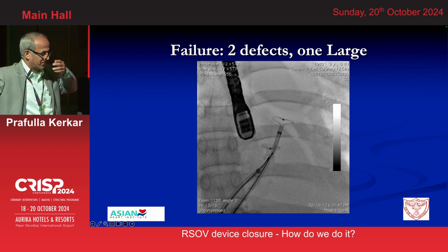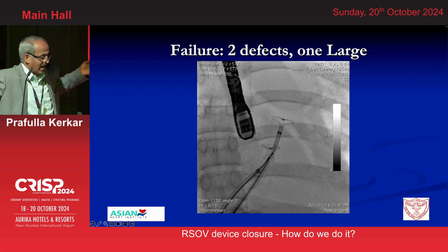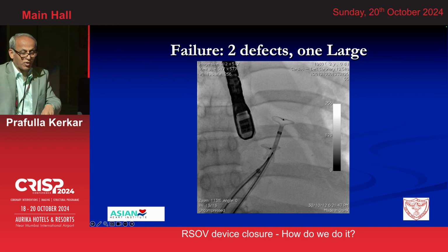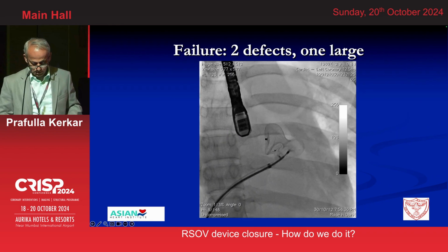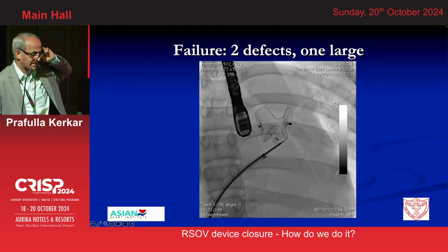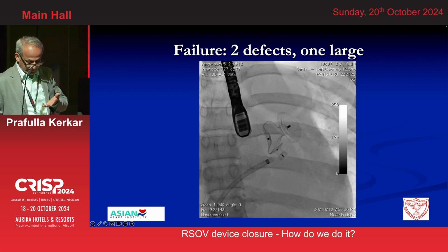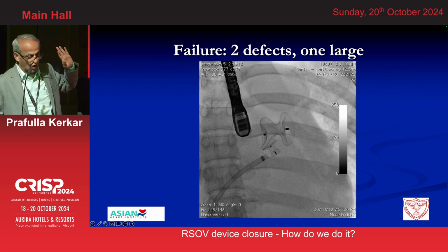The patient was virtually in multi-organ failure, a goner kind of a thing. Here there were two defects, and we crossed twice. We managed both, and we released the smaller defect at the exit point we closed. The larger one we were not able to do. So we used what I would never ever use in an arterial level shunt, an ASD device. You can see by the size of it, it is such an oversized device, it has no business being there. But our joy was short-lived.